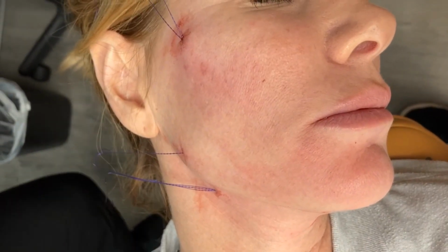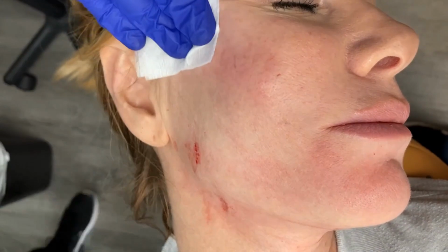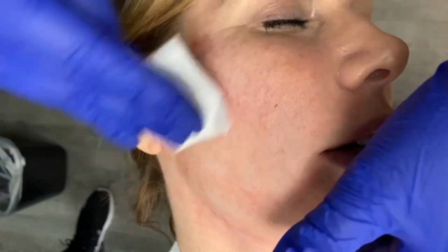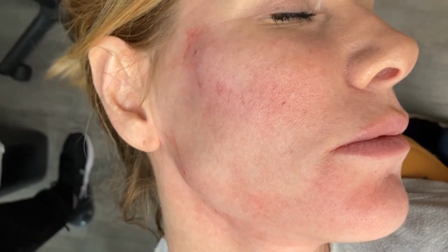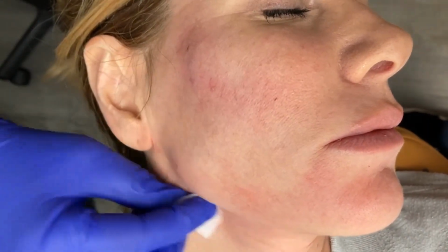Now it's time to trim these off, and we are going to grab them and pull them tight against the skin. Sorry you can't see this, it's hard to see, but we're going to pull them up and tight, go right against the skin, and make sure you clip these. That goes very quickly, and you want to then pull the skin over those entry points so that will hide all of these threads here. So you can see she may be a little black and blue once we are done, and that would be perfectly acceptable. This is not going to give her much to any problem afterwards, and anything that may be a little bruised can be hidden with makeup, so the patient will be very pleased.